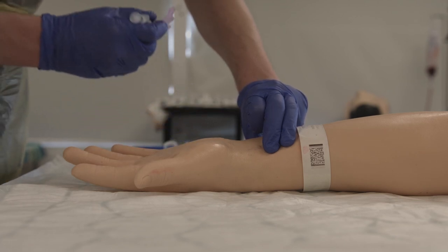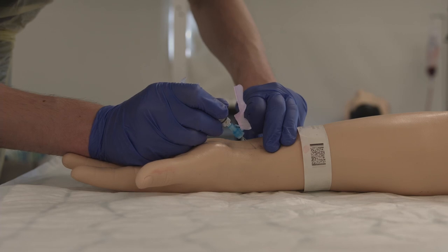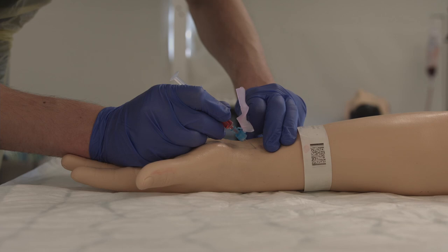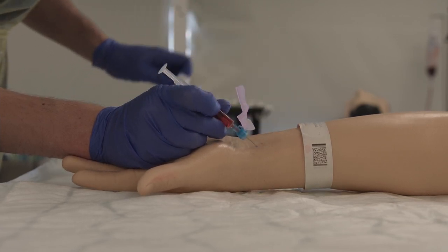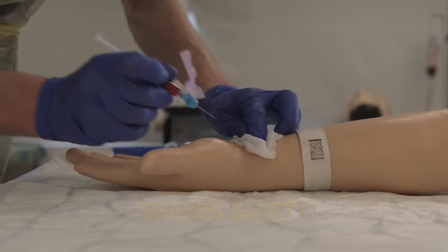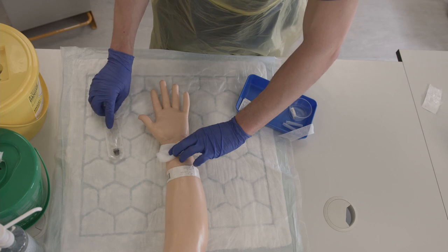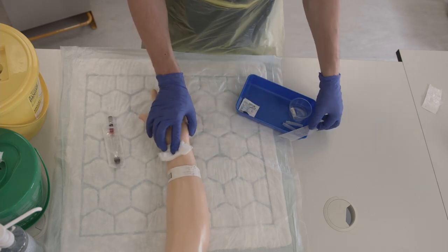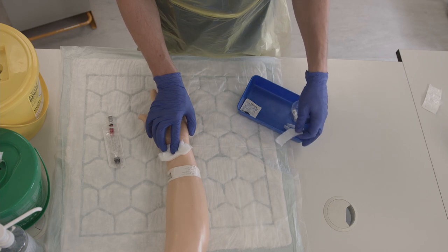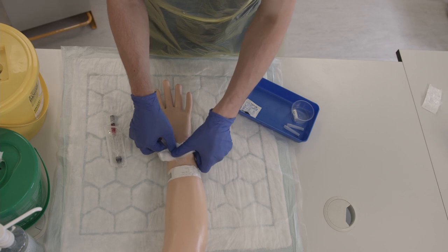Take your ABG syringe and insert it at a 45 degree angle. Insert it firmly until the syringe starts to fill with blood — it should fill by itself, however you can draw back on the syringe if it does not. Release your left hand and apply pressure to the area with gauze immediately after removing the needle. Pressure should be applied firmly for 5 minutes, but the examiner will likely tell you to stop before then. Cap the needle and put it straight into the sharps bin. Put your syringe into your pack until you have taped down the gauze.